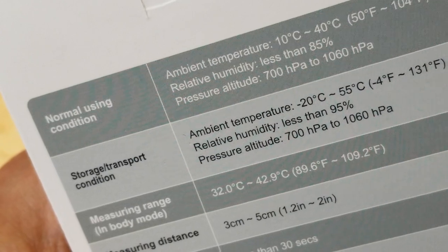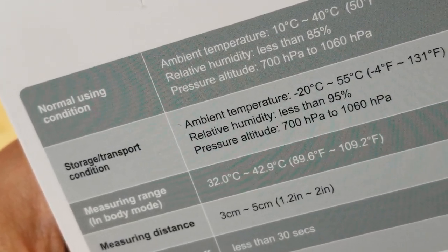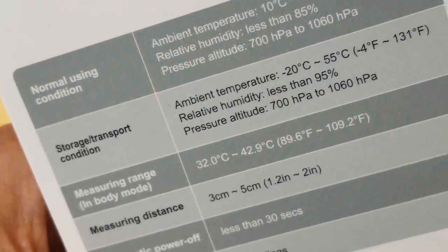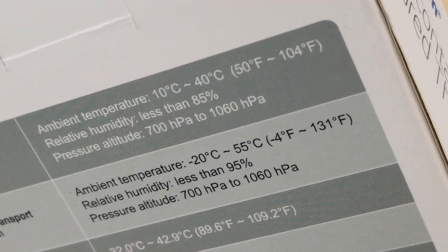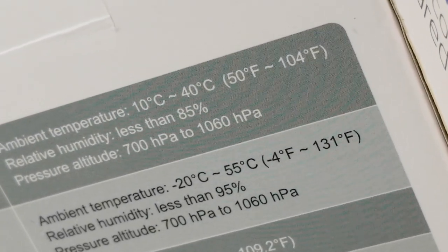So here are the specs. Normal use temperature from 10 degrees Celsius to 40 degrees Celsius, which is equivalent to 50 degrees Fahrenheit up to 104 degrees Fahrenheit.